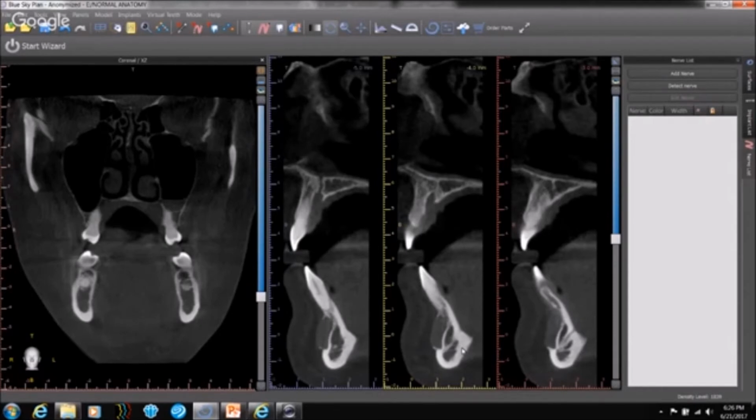It would be unfair to judge a patient as osteoporotic or osteopenic and therefore unhealthy for implant procedures, because this is very common as age proceeds. They may not be exactly unhealthy. It's just a matter of knowing that you want to look at these things, so that you pick the right implant, you do the right planning, and so forth.